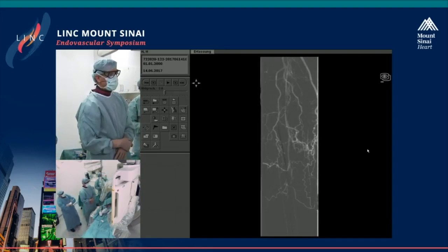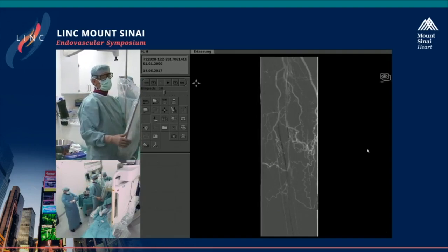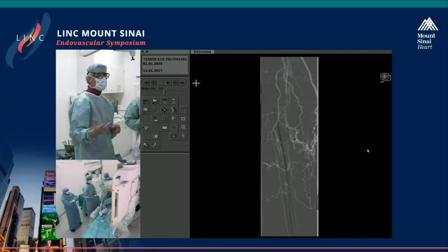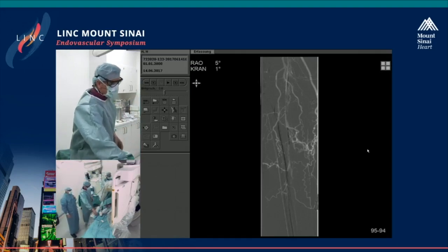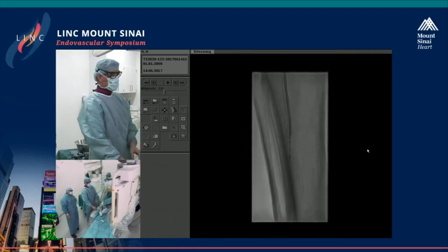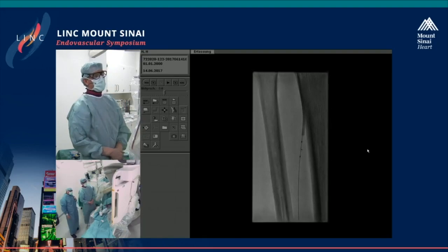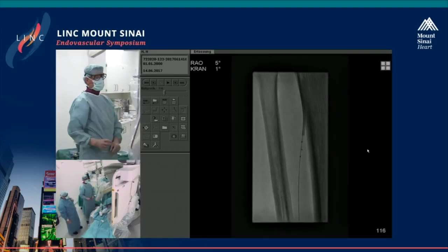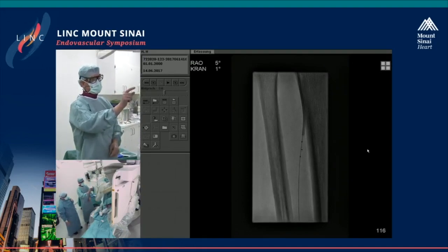This is a small device. It's a 2-millimeter device, which is possible to use here in arteries of diameter 2 to 4. There are 2 more others for bigger arteries. And you can see here now, if I enlarge, I'll take the bone a little bit away. Maybe, yeah, that's better. So you can see here now, this is the newer version. It's an over-the-wire version. With this, you can also twist. You can see here now 3 markers.